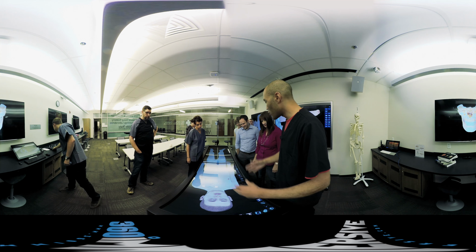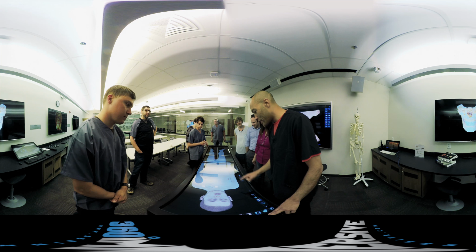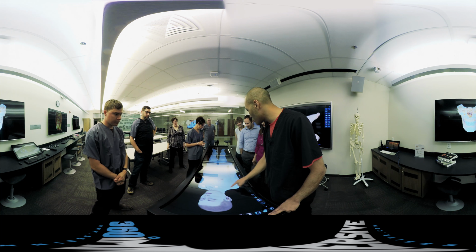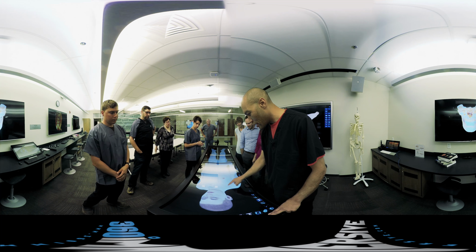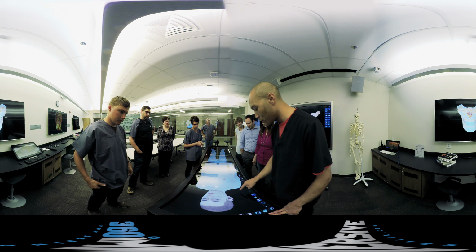Okay, you guys, so this is our Anatomage table here at ISU Meridian's virtual laboratory. Really nice. We have a touch screen so you can rotate the model in any direction that you want. We can customize and dissect as we want. Let me show you first dissection. We can do it in any plane.